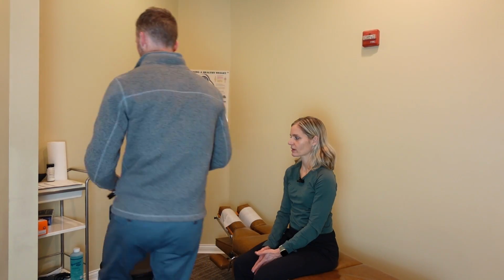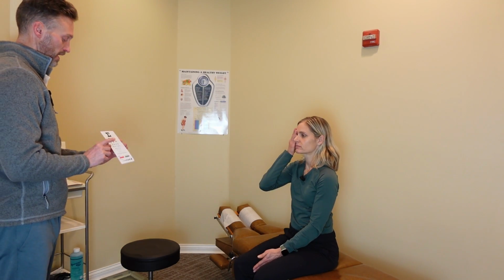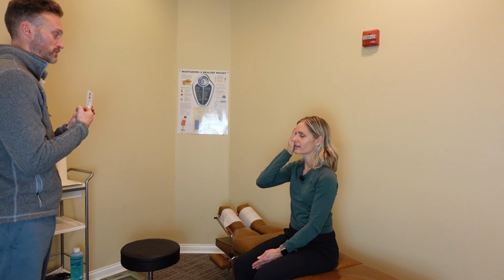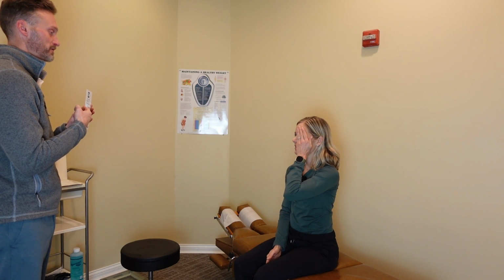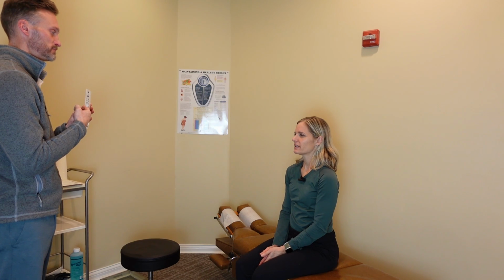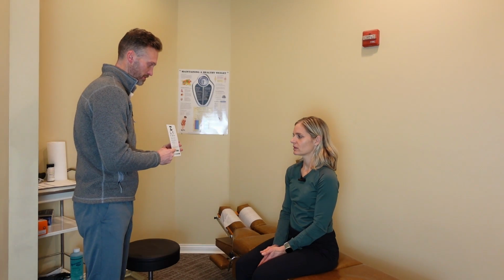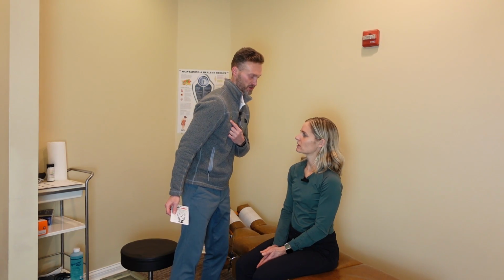The next thing that we're going to do is check your vision. So, what I'm going to have you do is cover up one of your eyes, and I'm going to have you just read one line, that line. DHJBS. Cover the other eye and read the same line but backwards, back to front. SBJHD. Both eyes open and read it forward one more time. DHJBS. Good. Now what color is this little box? Red. This one? Green. And then what color is this little symbol on my shirt here? Yellow. Good.